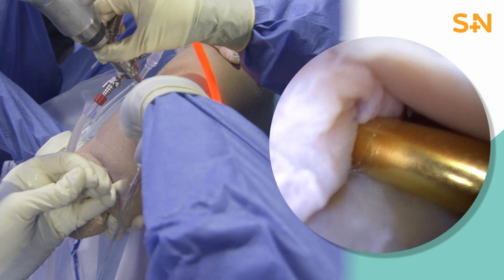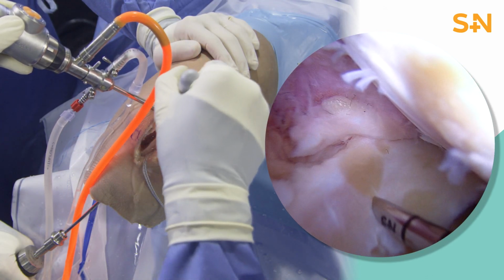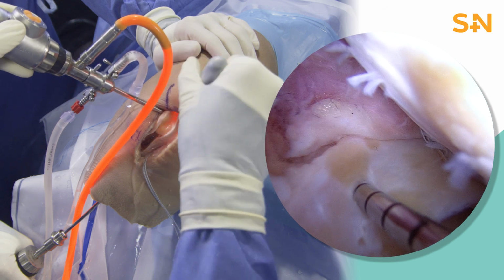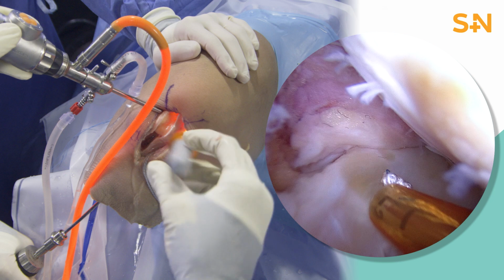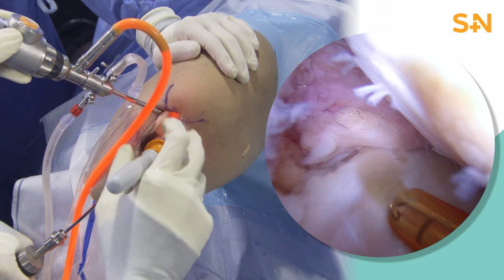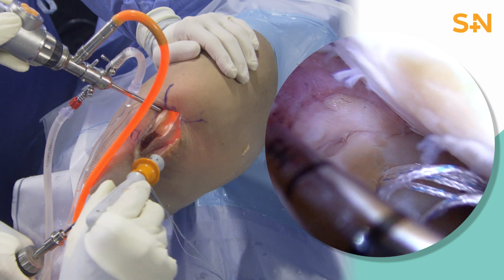A Novocut suture manager can be used to assist with tensioning the knot as well as cutting the sutures when optimal tension has been achieved. A slotted cannula is inserted again to stabilize the meniscus, enhance visualization, and minimize skiving of the delivery needle to ensure more accurate placement of the implants.